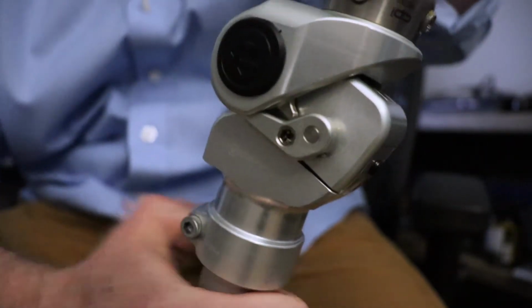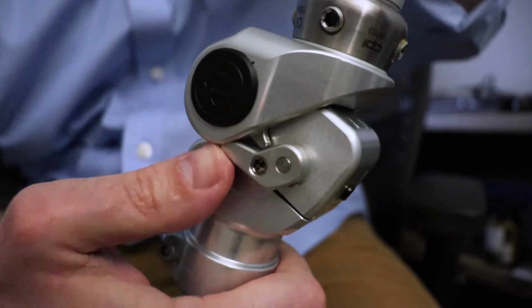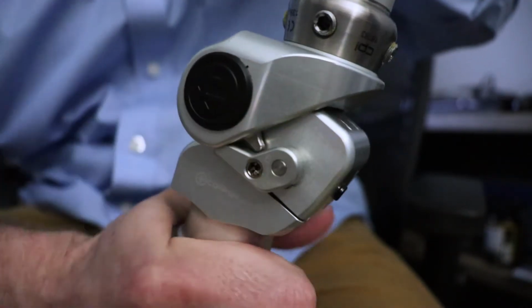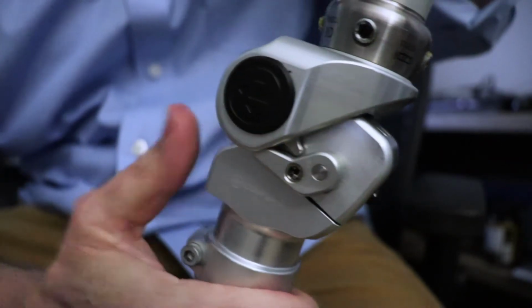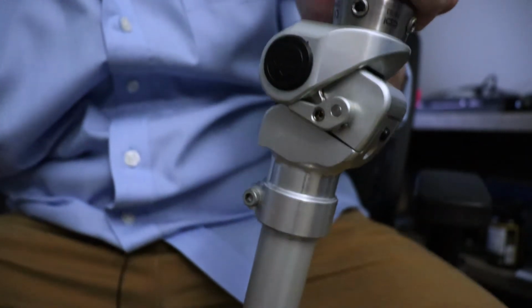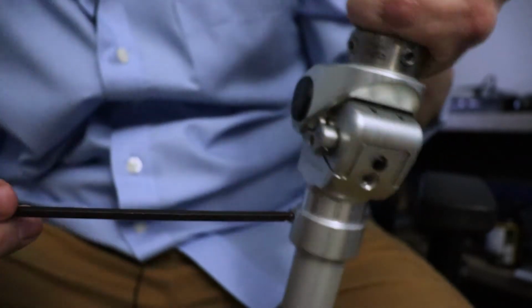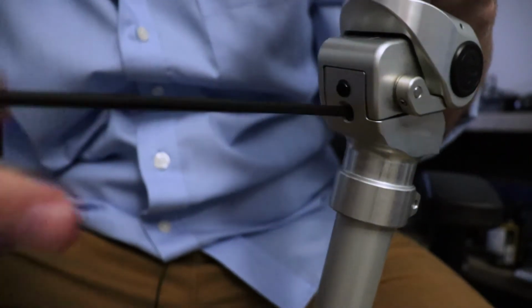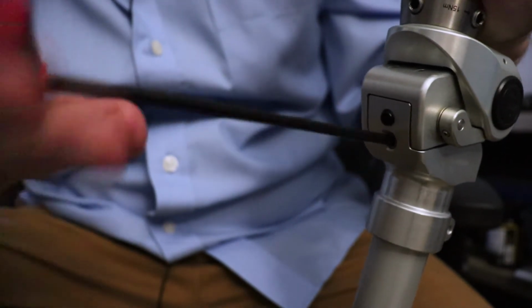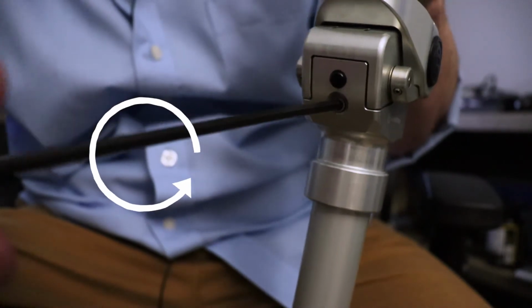Okay, now I can't remove it anymore. Now when I push down on this lock, I can't unlock it. It just won't unlock. Removing too much of that stance flexion can bind up the knee, especially when you have the brake set at the most sensitive. So now I will go ahead and reintroduce that stance flexion. I'll max it out again by turning that dial counterclockwise.